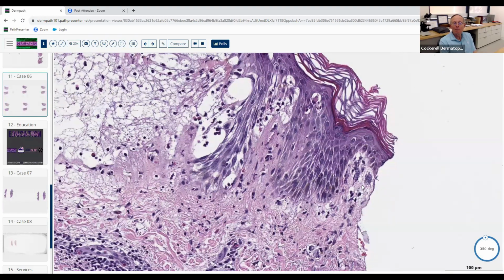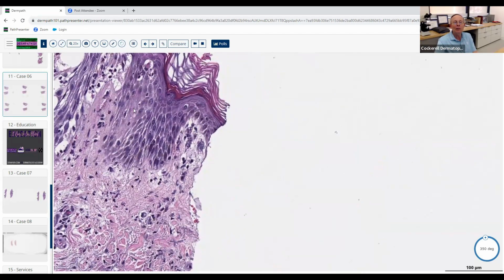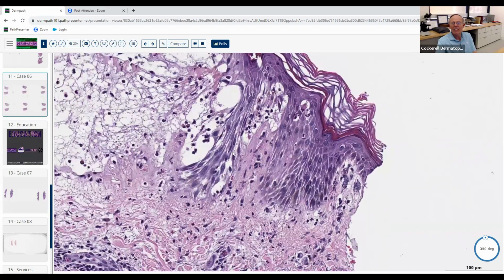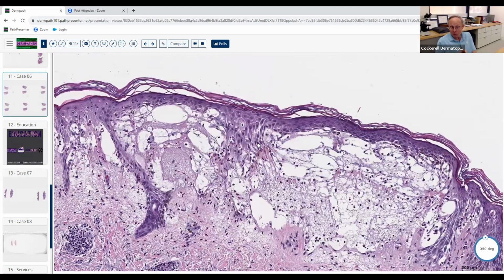It's a little confusing in a way because if you get a real super early lesion of DH, so let's say we just had something over here, we've got some neutrophils at the tips of this dermal papilla, and we don't really have much else going on. This is what you see in a very early urticarial lesion of dermatitis herpetiformis. That's what this looks like. When it becomes really inflamed, it starts looking like this, and eosinophils come into the lesions also. So neutrophils are the first cell that comes in. So you get IgA that's deposited. IgA is chemotactic for neutrophils. The neutrophils come in, they're secondary to the IgA deposits.